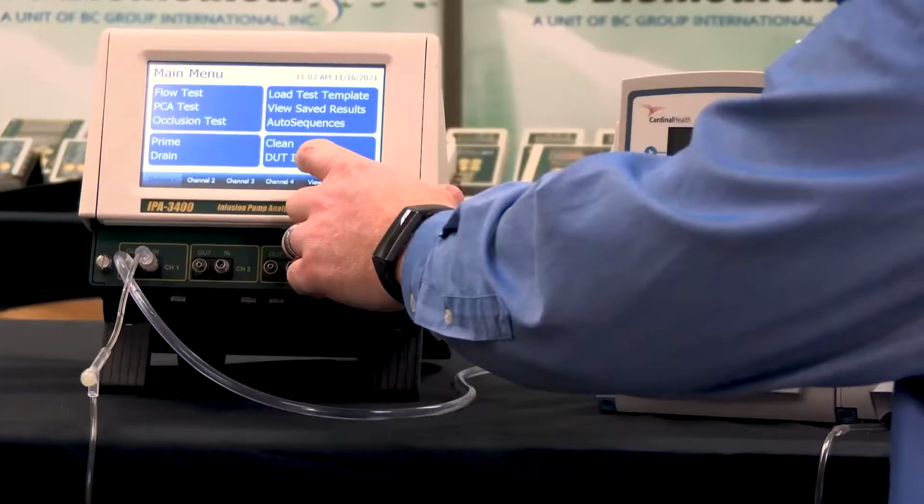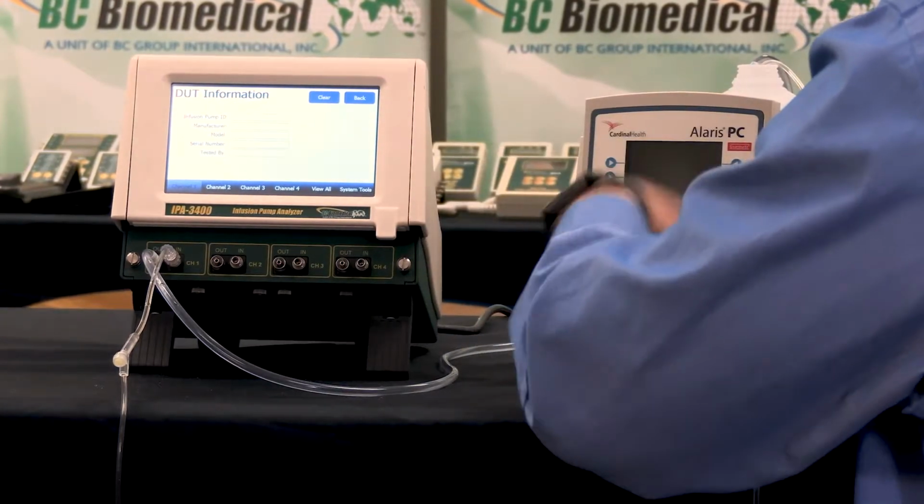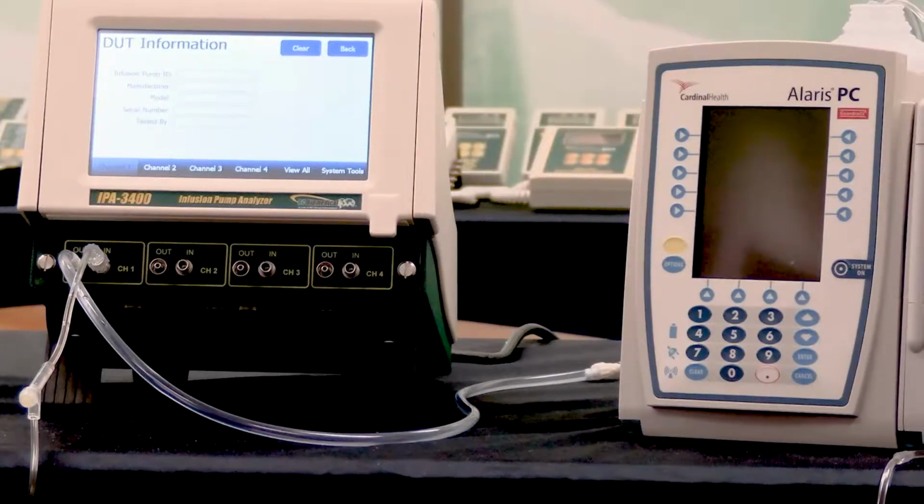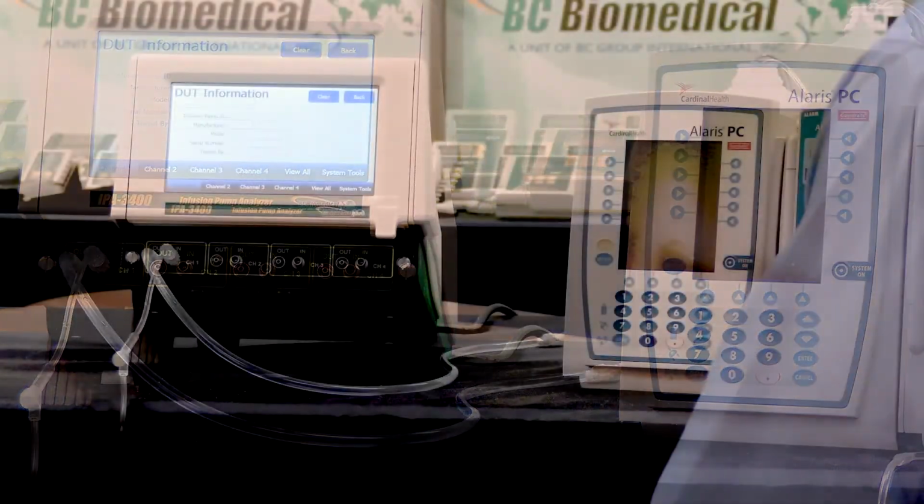So, DUT information allows me to put information in. Can you use the syringe to force the residual water out? Oh, yeah, you can. Should we not do that when they send it in for a cal, so it doesn't freeze in there? Well, when we do the cal, we use the Micro 90. I know, so it's essentially cleaning. If I'm sending it from Minneapolis to here in the winter, shouldn't they drain all that water out? Oh, drain, yes. You should do the drain before you ship. That's correct.